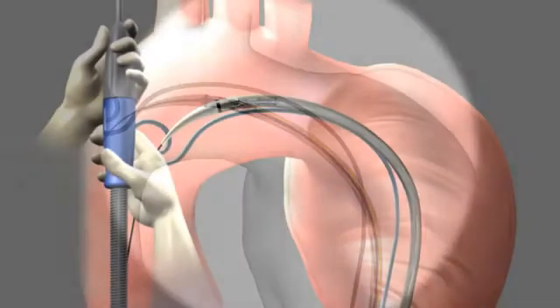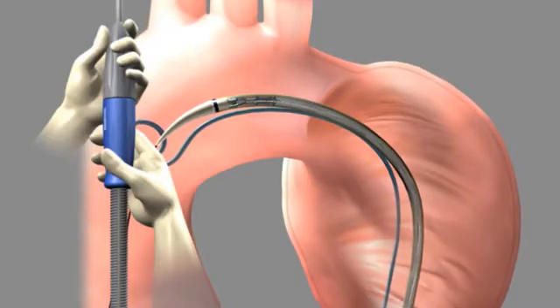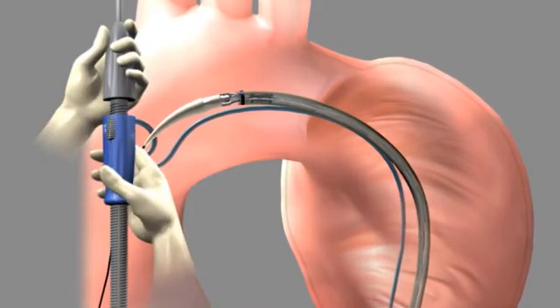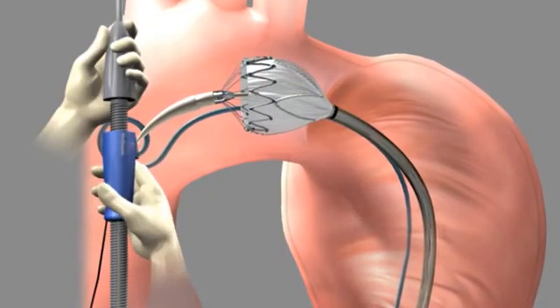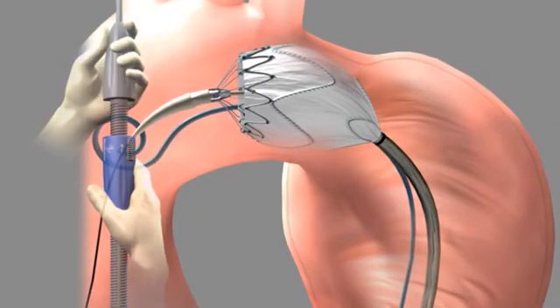To deploy the proximal end of the graft, hold the front grip steady with one hand. Slowly withdraw the graft cover with the other hand by rotating the external slider. The proximal bare spring will continue to be constrained by the tip capture. Withdraw the graft cover of the proximal main stent graft until up to two covered stents are exposed.